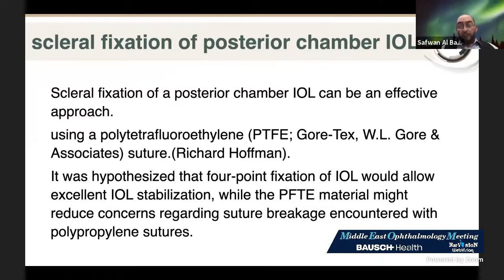It was hypothesized that 4-point fixation of the IOL would allow excellent IOL stabilization, while the Gore-Tex material might reduce the concern regarding suture breakage encountered with a polypropylene suture.